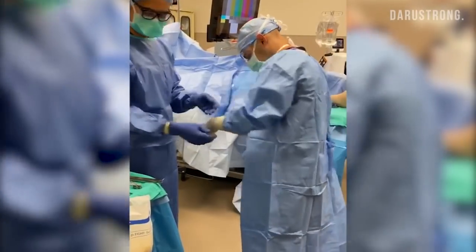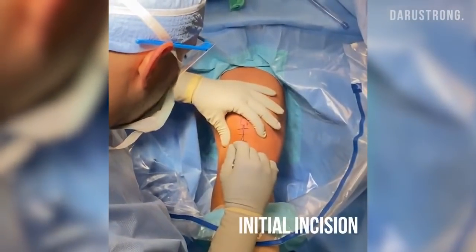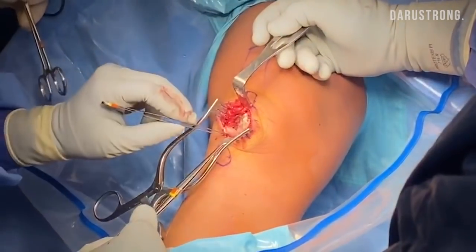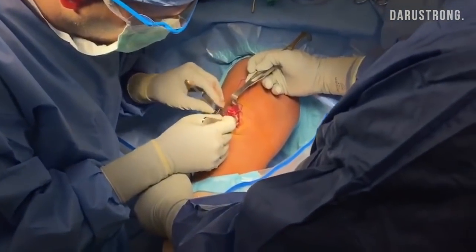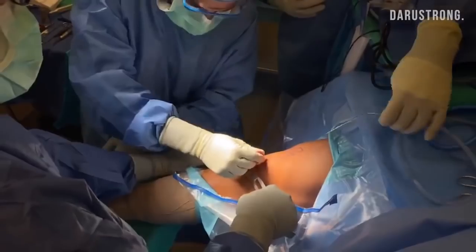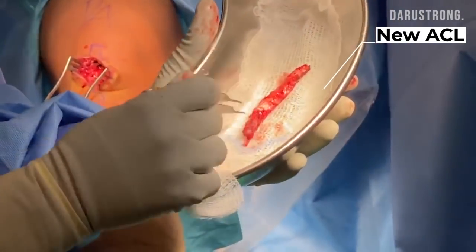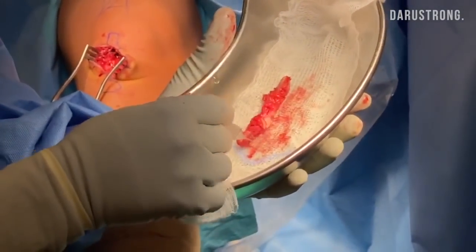Got the glove. Start our incision. Let's get our bone. Here's our bone plug right here. Now we've got our bone plug freed up on top. Now we just got to follow it down to get our tendon all the way through to the bottom. With our graft, once it comes out, we want to keep both hands on it — we do not want to drop this. Central third of the tendon, this is facing the inside of the body here, and here's our tibial bone plug. So if we flip it over, this is going to become Phil's new ACL that we're going to reconstruct.